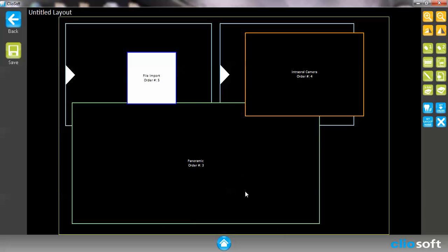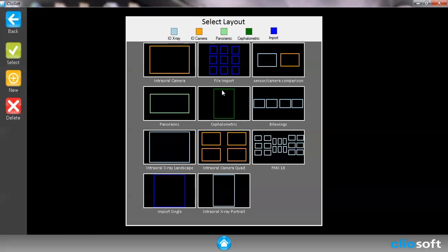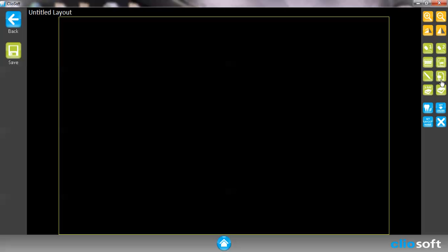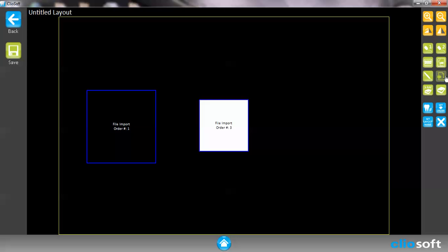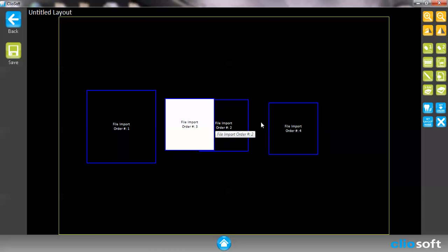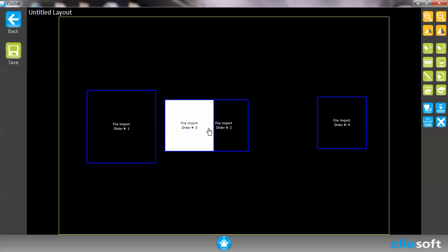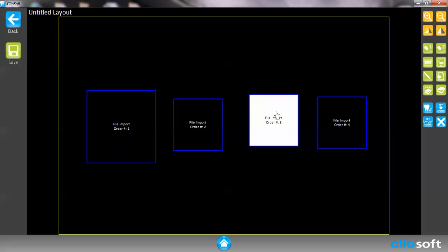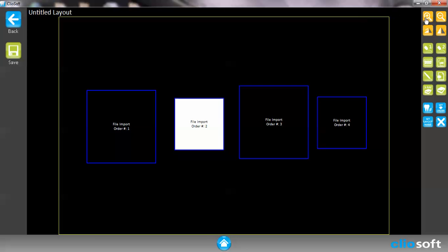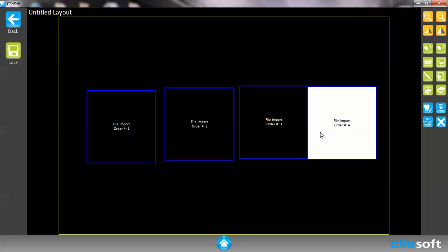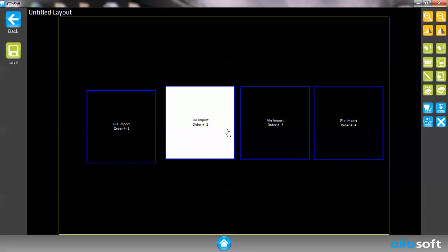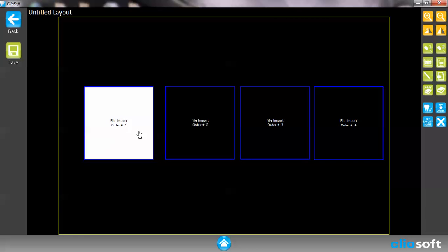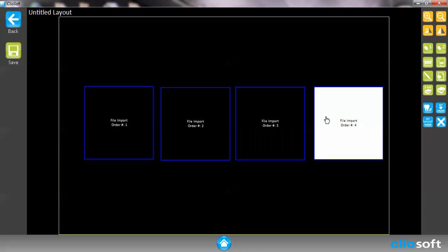So let's go ahead and clear all this. I'm going to hit back. I'm not going to save it and I'm going to show you. For example, if I hit add import I can create my own bite wing series. If I want to save this, go ahead and save it.